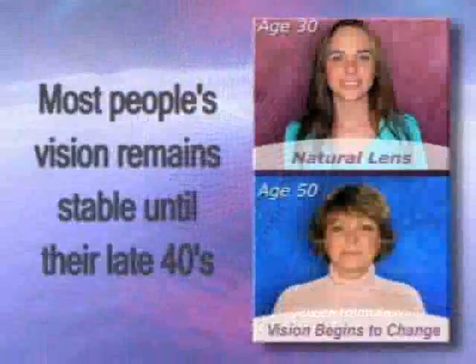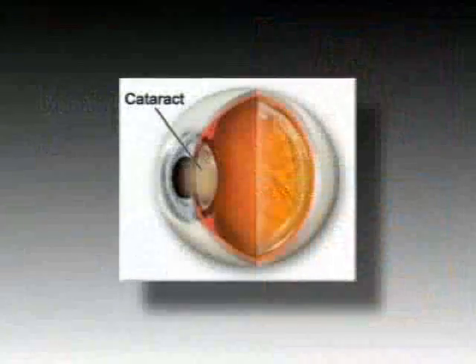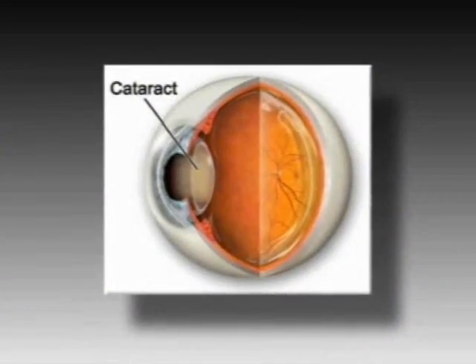As we get older, however, our eyes lose the ability to accommodate. We may develop cataracts, which cloud the natural lens and can prevent a clear image from forming on the retina. Today, cataract surgery is one of the safest and most common surgeries, with approximately 3 million procedures performed in the United States each year. After we remove your cataract, it is replaced with an artificial lens called an intraocular lens implant, or IOL. It is important for you to understand that you now have a choice to make regarding the type of lens you will receive.